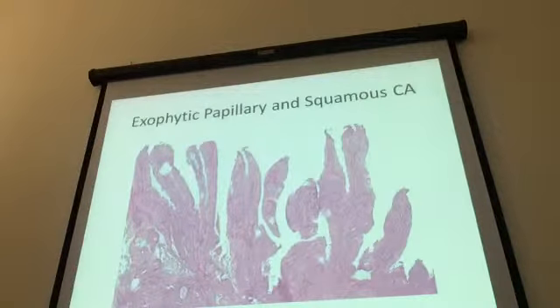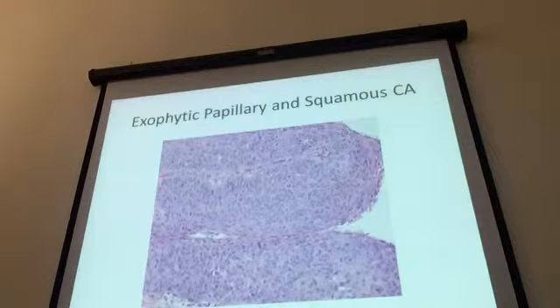It's not like verrucous carcinoma. You can tell this is cancer cytologically. The cells look bad. Here's what they look like. You can see they're disorganized. There's dyskeratosis. There's mitoses. It looks like cancer.